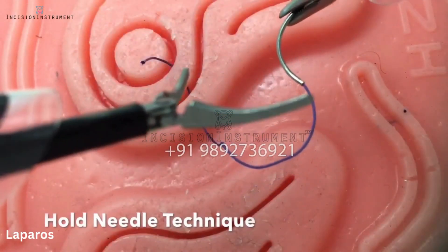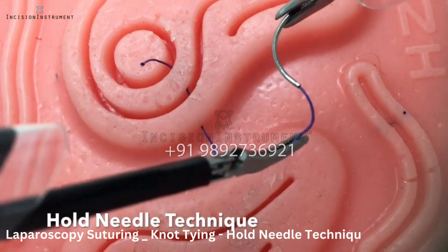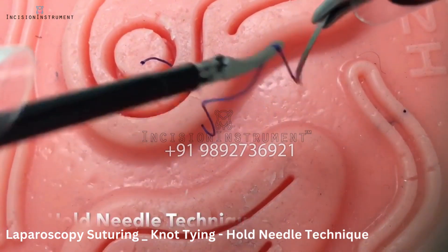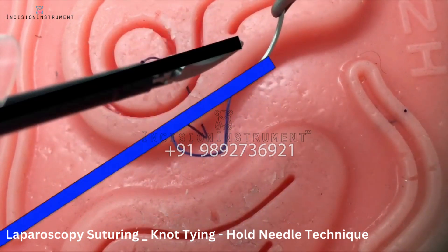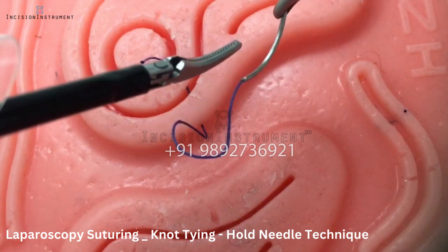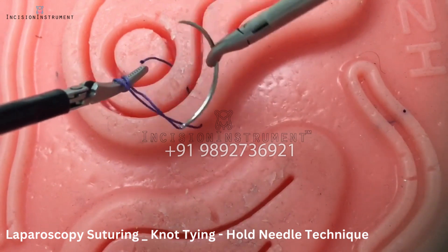This technique may be beneficial with shorter sutures. In contrast to the drop needle technique, here the needle is constantly held. The key principle is to rotate the needle to line with the suture and to minimize the instrument-to-suture angle. By creating this almost parallel angle and utilizing the sturdiness of the needle, wrapping your suture on your left instrument becomes virtually effortless.